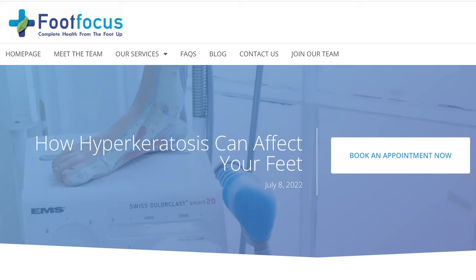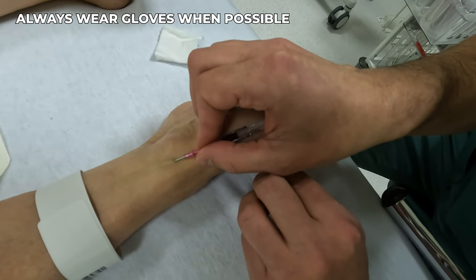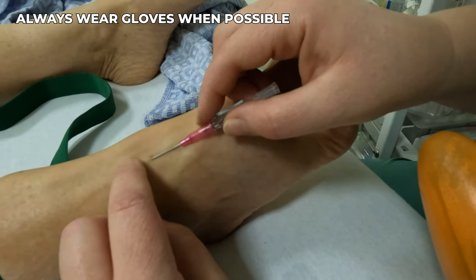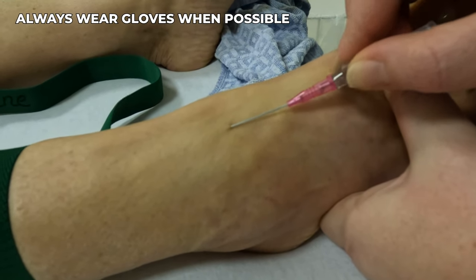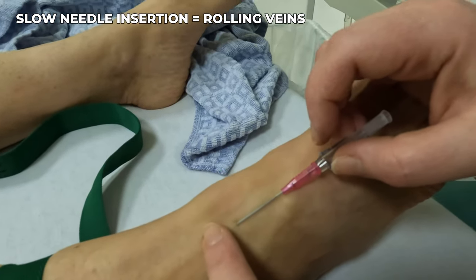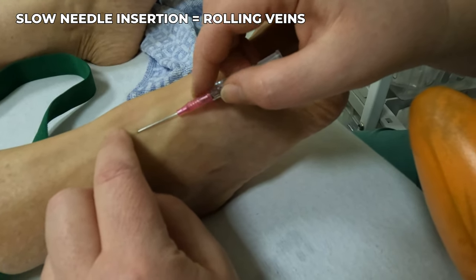Additionally, the skin of the feet is typically thicker than the skin of the upper extremities, which further demands greater skill and swift execution to puncture the skin above the vein without causing the needle to slide off the sides of the vein instead of entering its lumen. Let's take a closer look at this video demonstrating an attempted IV insertion into the foot — you can see how the slow execution of the procedure causes the veins to roll off and complicate the intravenous cannulation process.